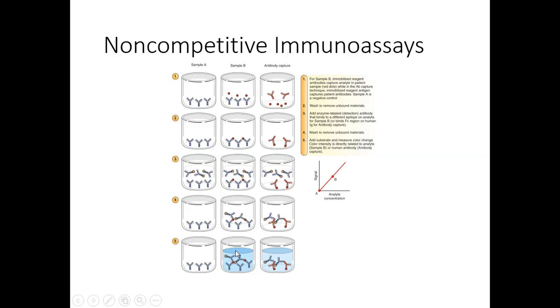We created a color. This has no antigen antibody. This has no antigen nor the bound or tagged antibody. You have no complex here, so guess what? That solution, the color change never happens. There was nothing there to bind that antibody to this solid membrane. This one did. This did have antigen present, so it caused a reaction. So remember, in non-competitive immunoassays, is it directly or indirectly proportional? The color change is directly proportional. So you can see the line is going in the opposite direction.